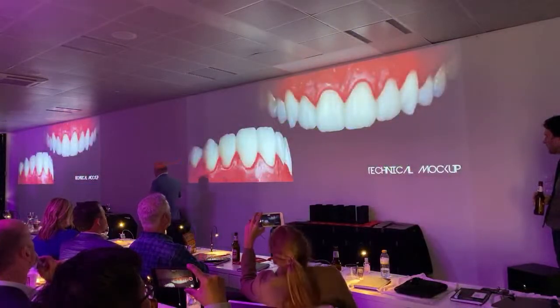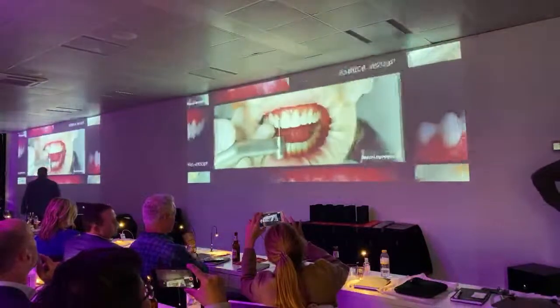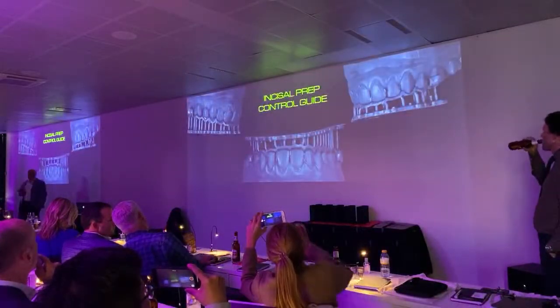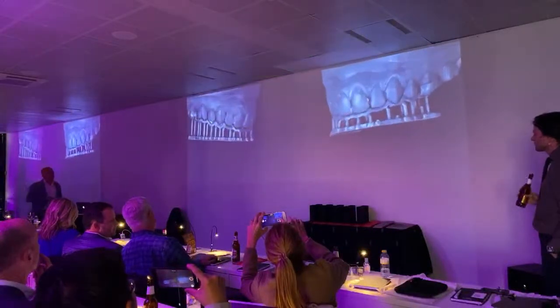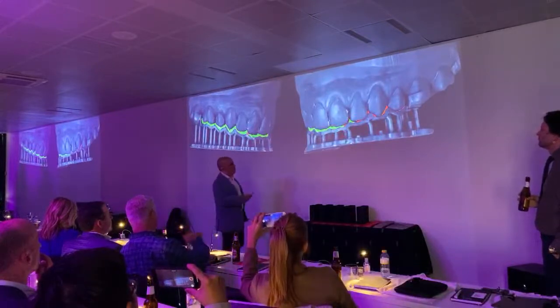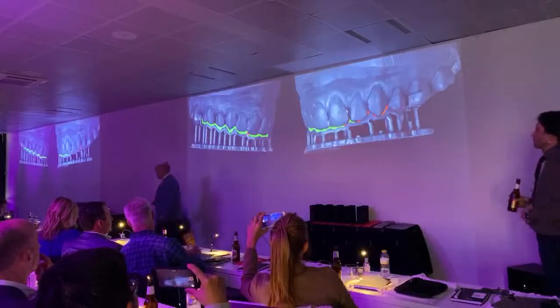Mock-up with the ideal project, ideal post-preparation. Okay? Prep through the mock-up, and you can control the preparation with these guides. Look how nice it is, because you can see where you need to remove more. This guide is guided by the ideal design, of course.